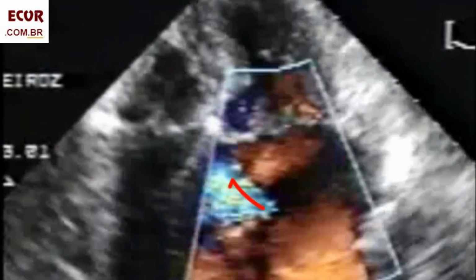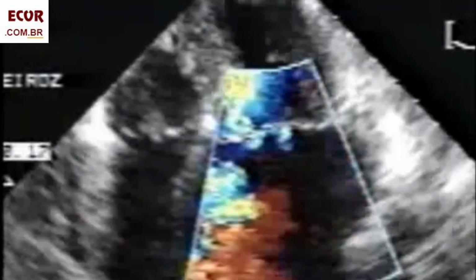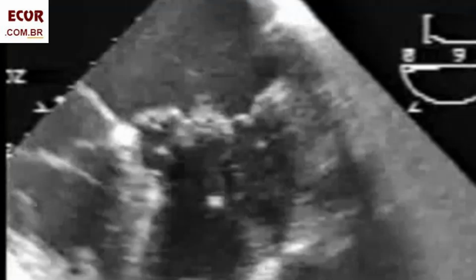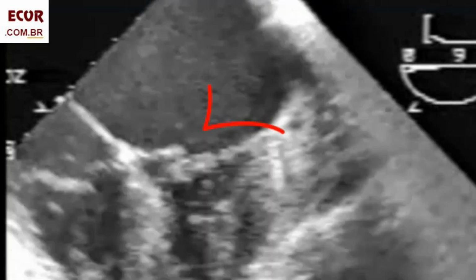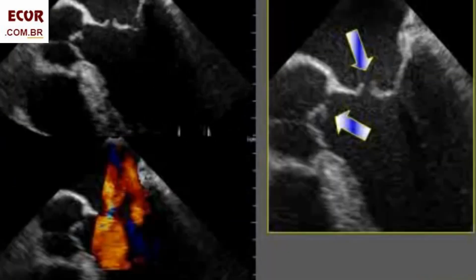The mitral regurgitation first fills the abscess cavity and then goes to the LA. As the ultrasound beam is large, you can see in the TEE of this patient the region of the leaflet not involved by the abscess and the abscess cavity, now a mitral aneurysm.